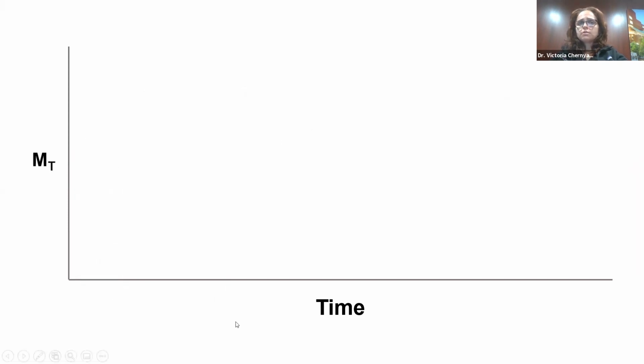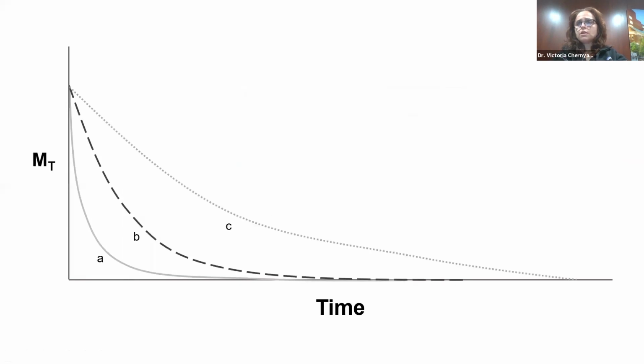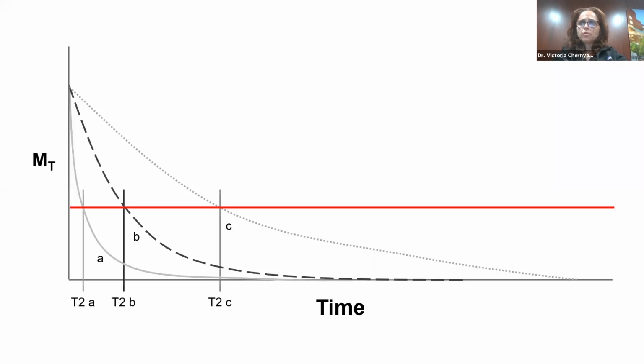In a similar concept, if we look at the length or magnitude of the transverse magnetization vector, we start out with a maximum, and then it decays over time. We can have tissues A, B, and C, and each one of them decays at a different time. And you can see that, similar to the T1 constant, the T2 constant is going to be very different between these tissues, defining how the curve decays.